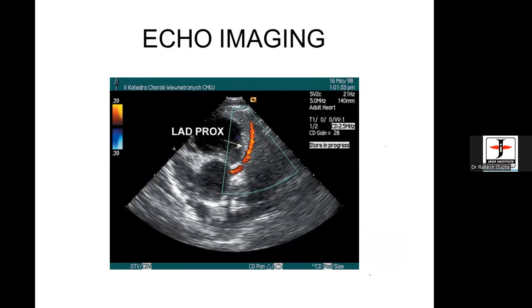Japanese people sit down together to look for only one coronary artery, either left or right. For 8 hours, they'll keep looking at these coronary arteries, and if they get one coronary artery in a day, they feel their day has been utilized. Sometimes, sir, we do get these things. We actually see plaques also in the left main.